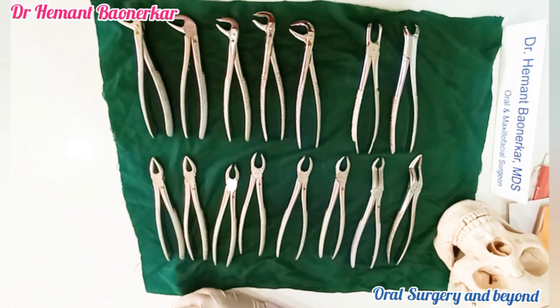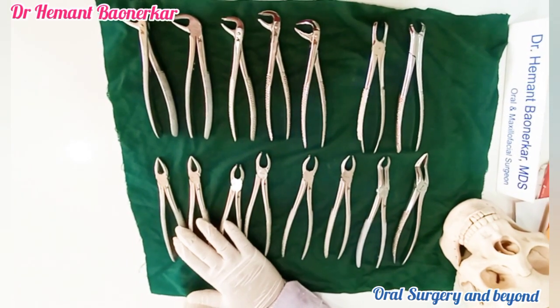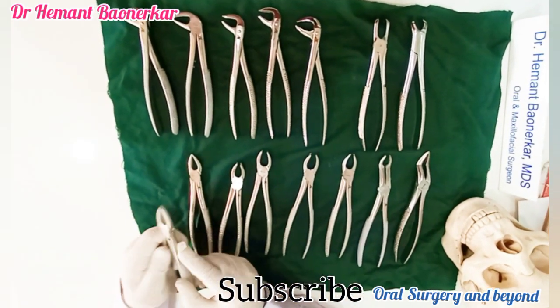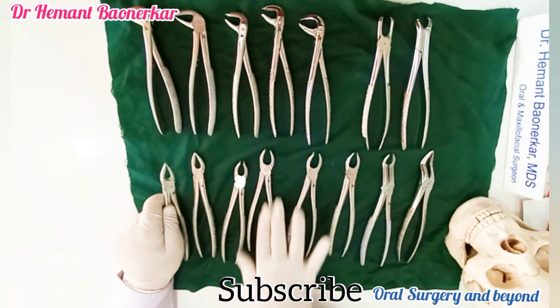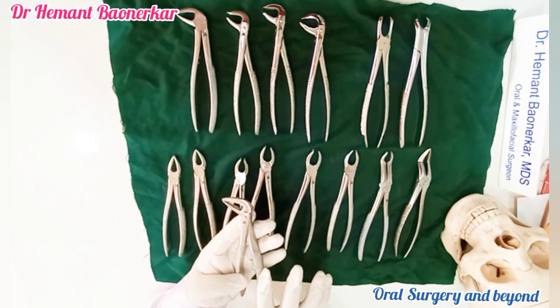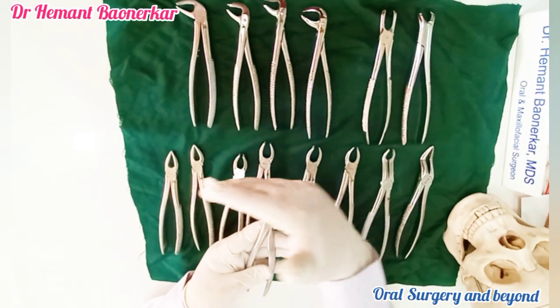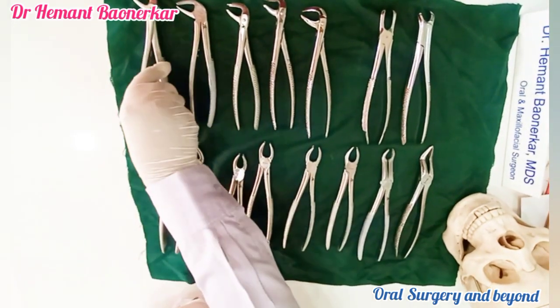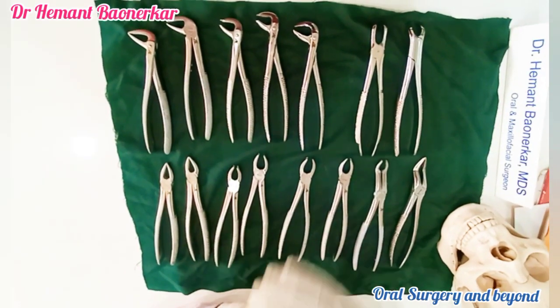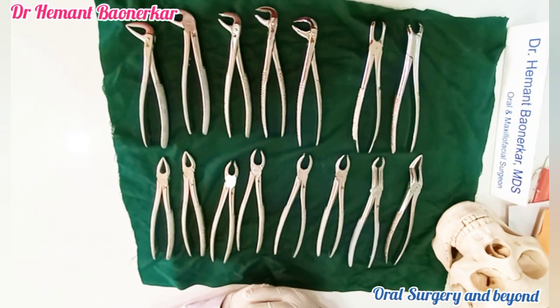Let us see what are the different types and how to identify which one is the maxillary forceps and which one is the mandibular forceps. Generally, maxillary extraction forceps are in a straight plane — the handle and working area are in one plane. But in mandibular extraction forceps, the handle, fulcrum, and working area are at 90 degrees to each other. So all mandibular extraction forceps are angular forceps. This is the basic identification mark.